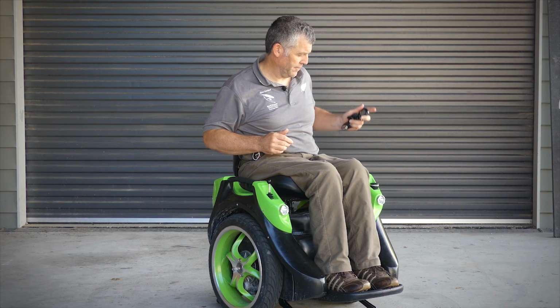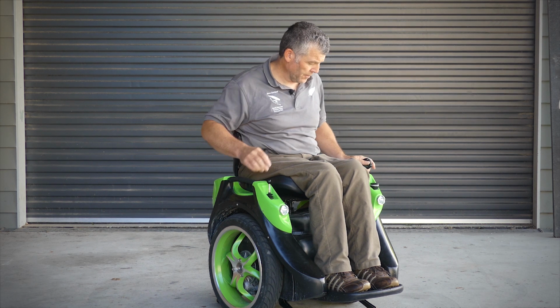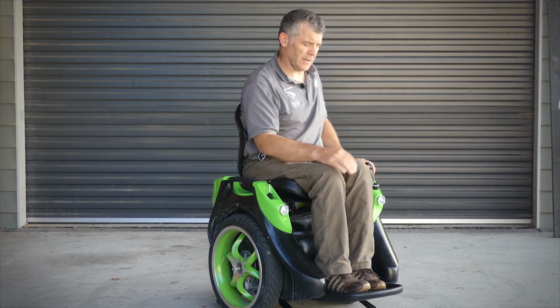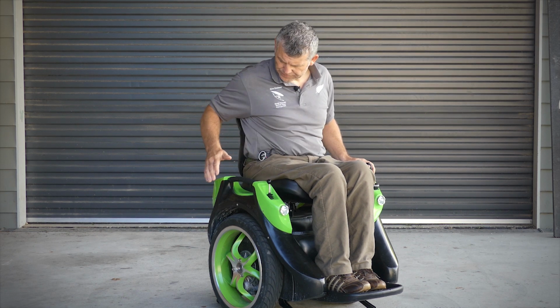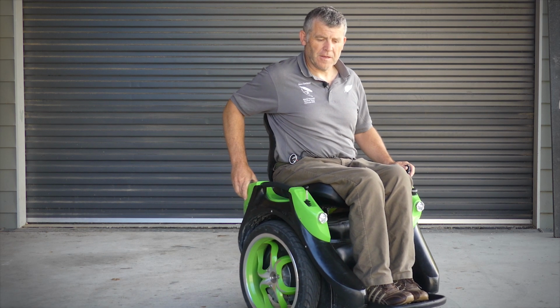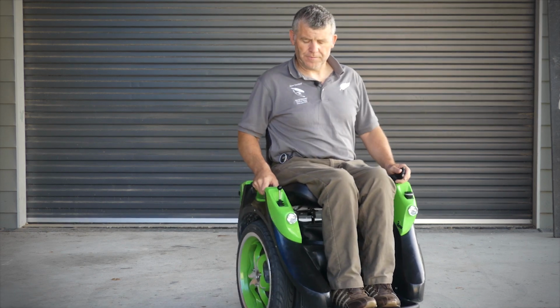So we power on. It'll go through red lights to green lights, green for go. Find our balance again, figure out why we went into the shutdown. Oh, that's right, it was the seat. It's all good now, we've got it level. Check our environment, legs up. Find our balance, over to seat steer, and ready to go.